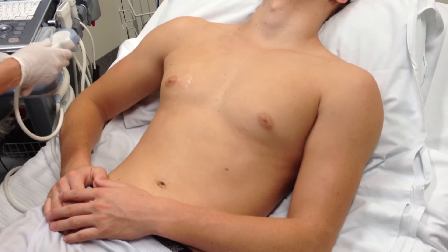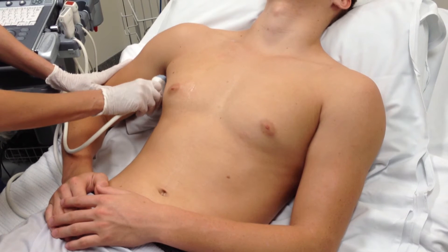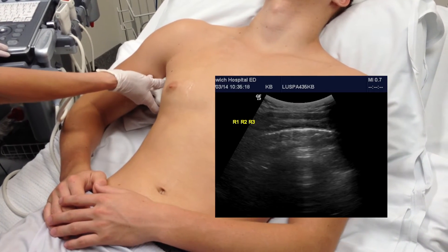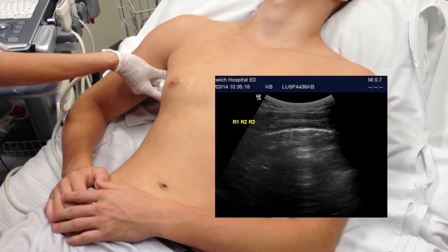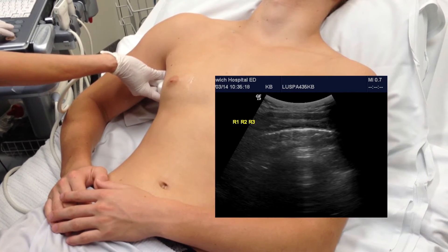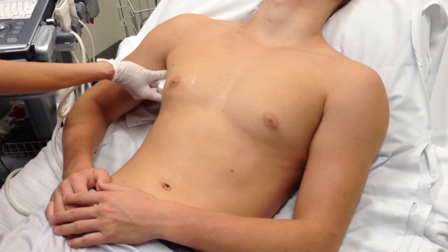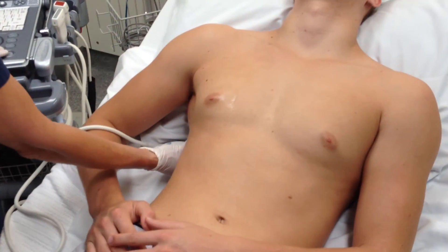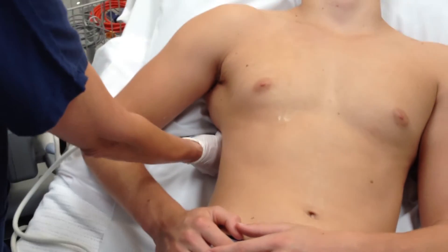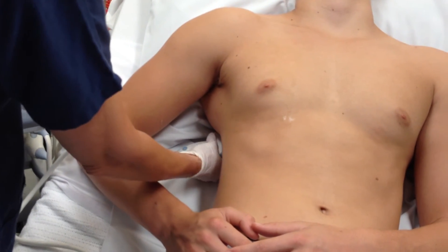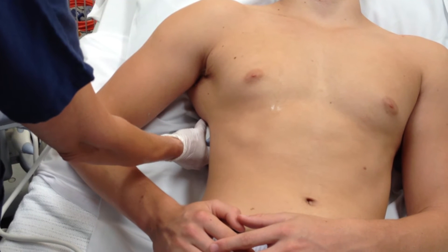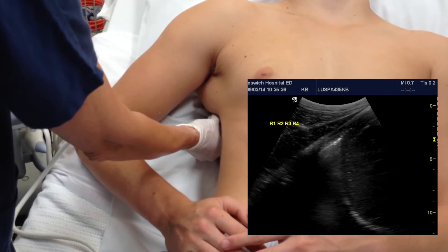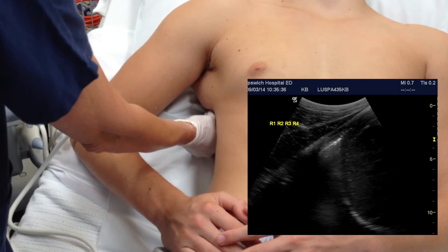Regions 3 and 4 are between the anterior and posterior axillary lines. Keep the arm at 45 degrees because the anterior axillary fold acts as a landmark. Often you're scanning tangential to the ribs so you may not get a rib shadow in view. The most posterior view requires your hand to be under the probe, virtually flat on the bed, because you want to demonstrate the costophenic angle and thus show the smallest of pleural effusions. It's good to have a bit of liver in the picture.